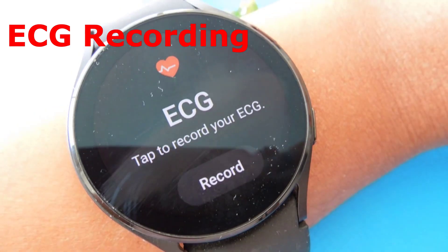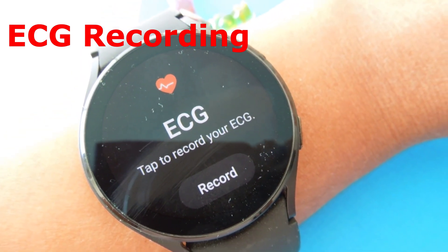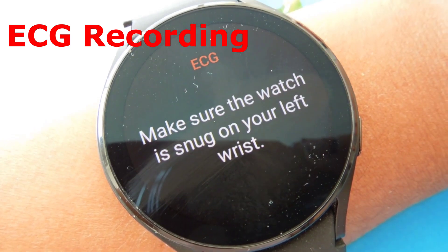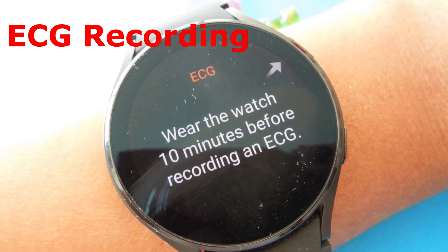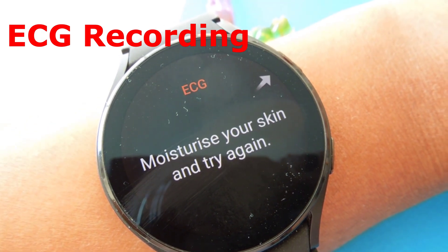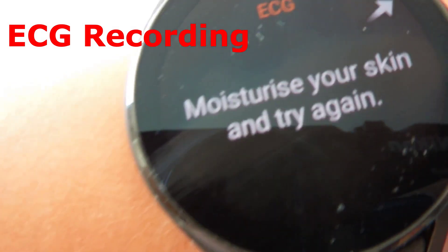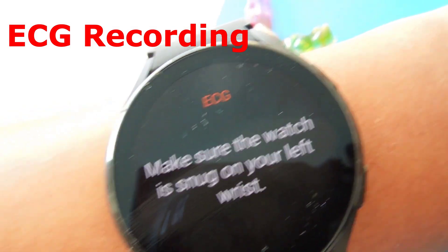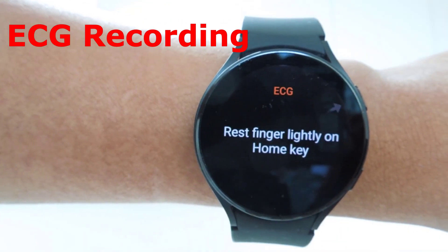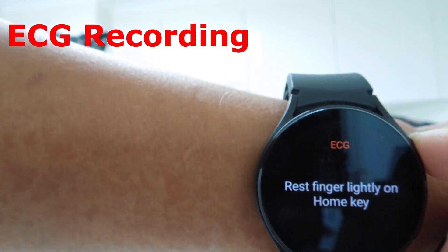The same result appears on the phone. To take an ECG, the watch does not require prior calibration. All I have to do is click on the record button on the ECG screen. It says to rest your finger lightly on the home key, make sure the watch is snug on your left wrist, and wear the watch 10 minutes before recording. It also advises to moisturize your skin.